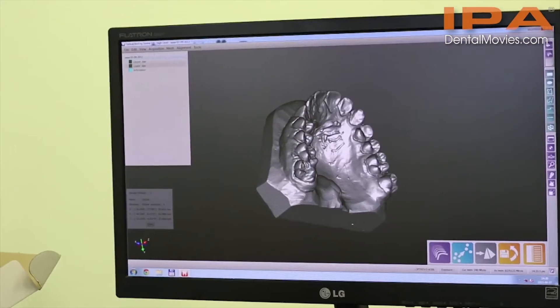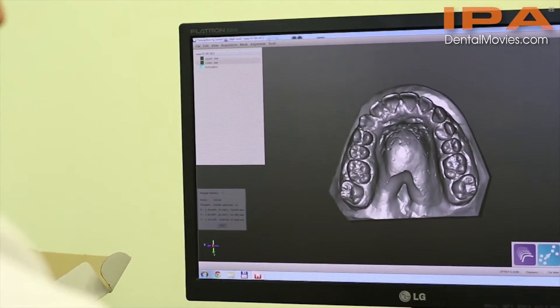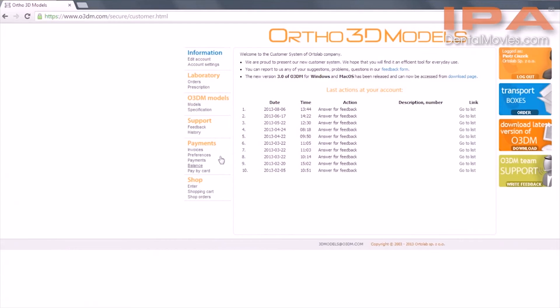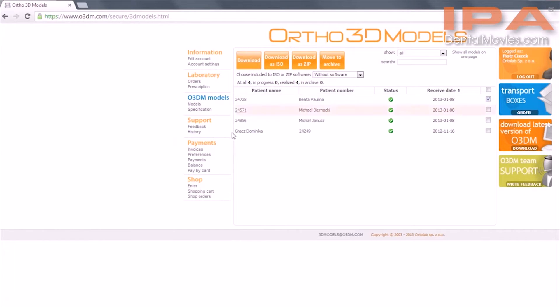The virtual model is placed and stored in the dentist's individual account on the webpage from where it can be downloaded at any time. The software enabling the user to work with models is available for free on the same webpage.